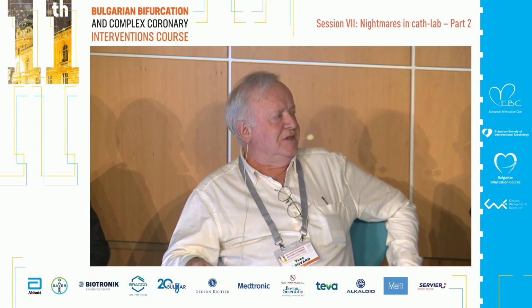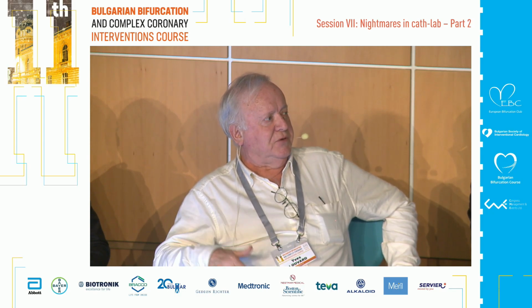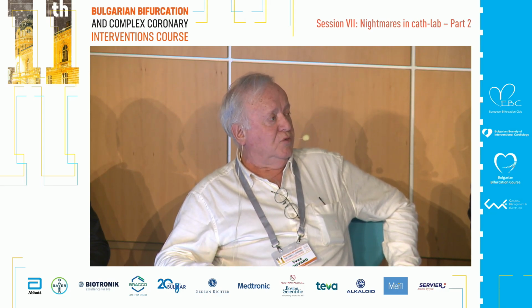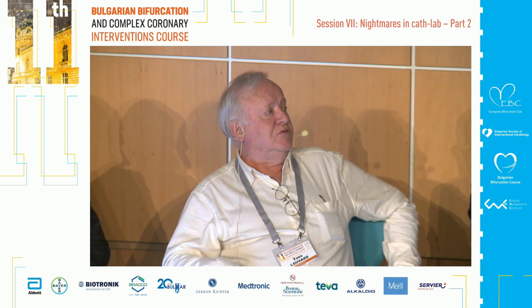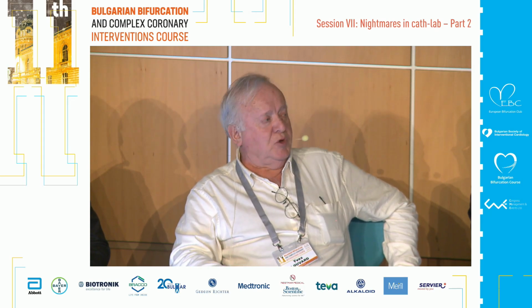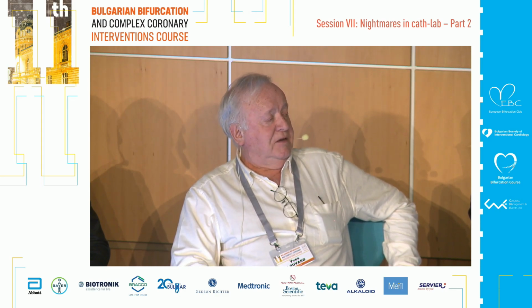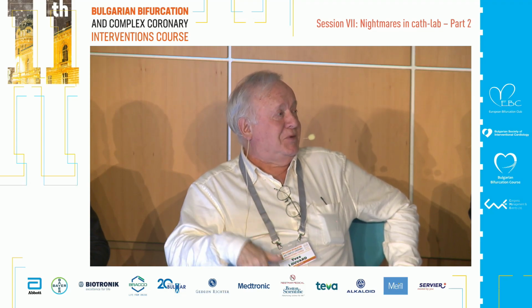So next morning, she had pain here, and the day after, they made a diagnosis of false aneurysm. I was not there. The day after, a colleague decided to close it with coils. And he put many coils to close it. It was effective. But after that, the lady had a nerve compression with some pain and loss of muscle there. And she sued me. I was not the one who put the coil.